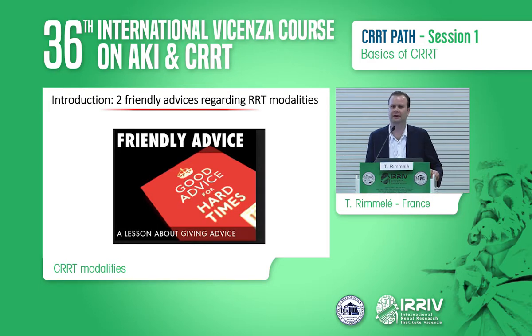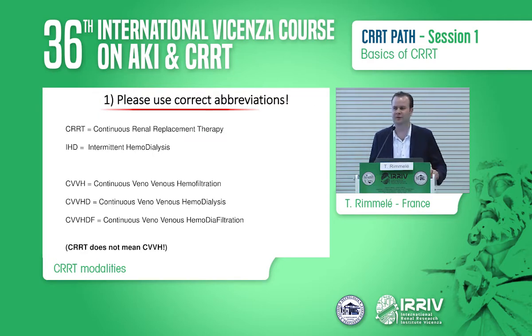So first of all, I would like, if I may, to give two friendly pieces of advice regarding renal replacement therapy modalities. The first one is: please use the correct abbreviations. I don't know about your units, but in my unit I have a lot of students, a lot of fellows, and sometimes also some attendings. They really do not use the correct abbreviations, and they very frequently use CVVH for CRRT.